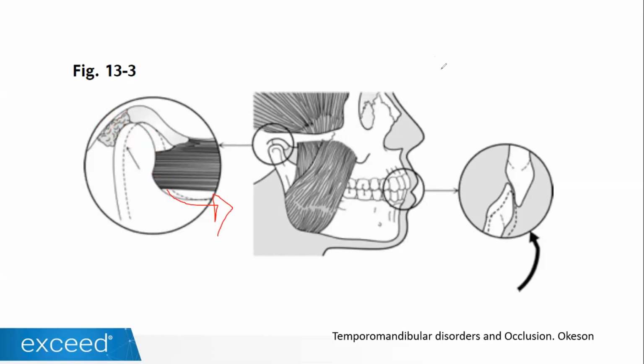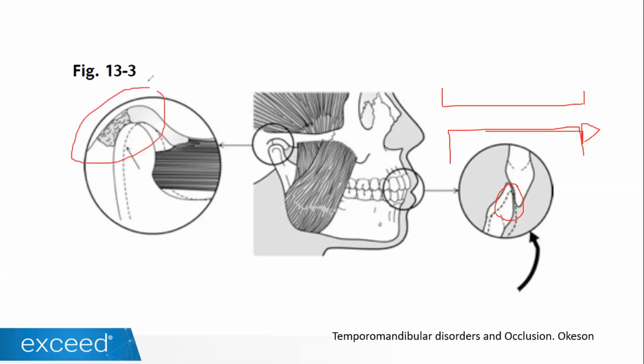So what happens when we are using aligners? You need to remember that we are disoccluding the teeth. We don't have any occlusal contact. This is the difference with braces. So by not having occlusal contacts, the mandible can move very freely. So there are situations when we have patients that have underjet and they have temporomandibular joint disorders and we didn't diagnose them, and as soon as we put that aligner on, and this is not a treatment that we do in 2 months, normally aligner treatment takes 1-2 years.